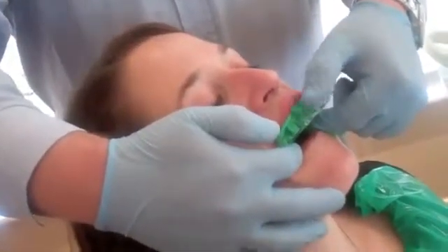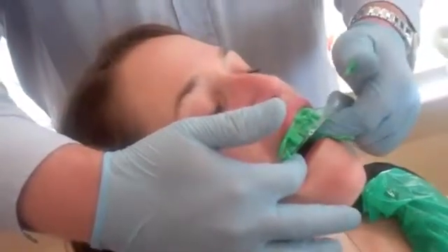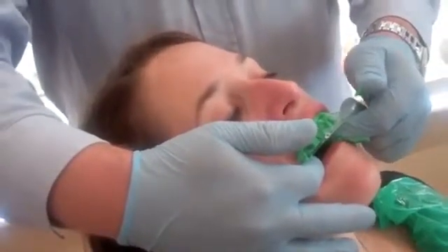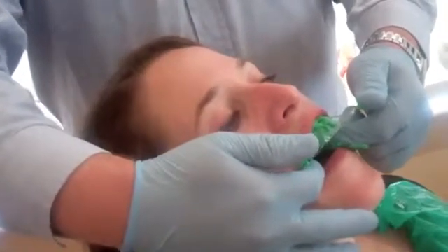I just touched with my thumb there to show how sticky this is. It's a massive problem also with people with facial hair like myself. If you get this material into a gentleman's beard or moustache, then obviously it's quite uncomfortable for them removing it.